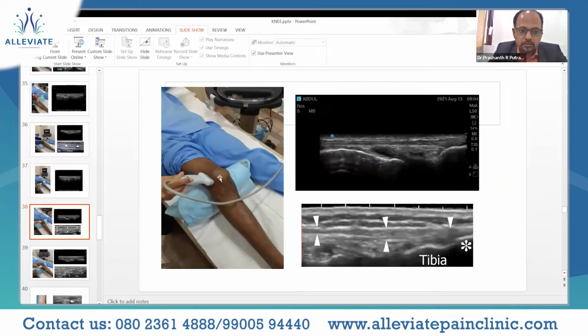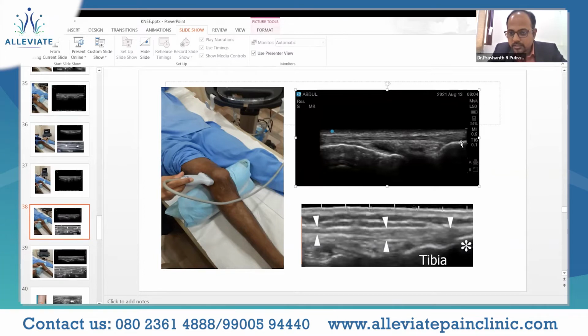And then further moving just medially to the patellar bone, we already discussed in anatomy the iliotibial tract, which comes and attaches onto Gerdy's tubercle on the tibia. So here you can see a nice band-like structure, extending all the way distally, coming and attaching onto Gerdy's tubercle. This is nothing but the bony process on the anterolateral aspect of the tibia, and that is the iliotibial band, which is clearly delineated over here.